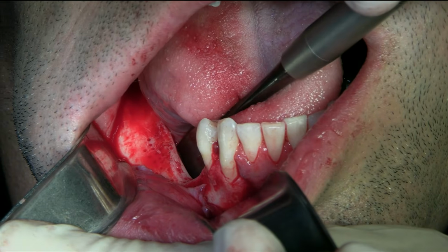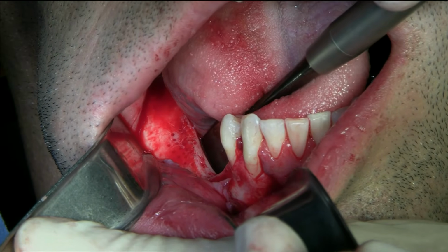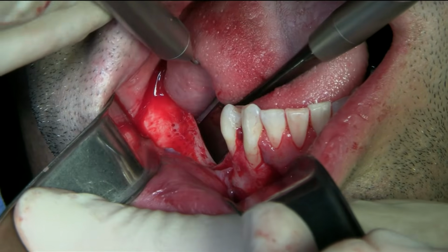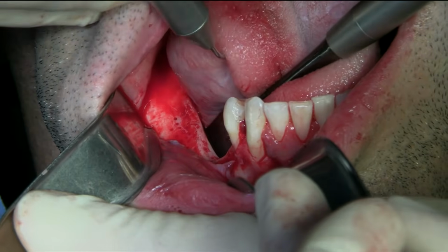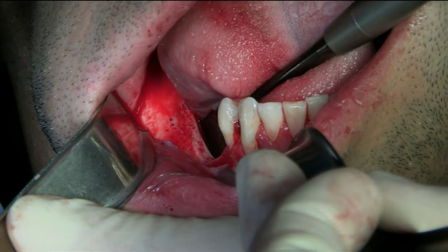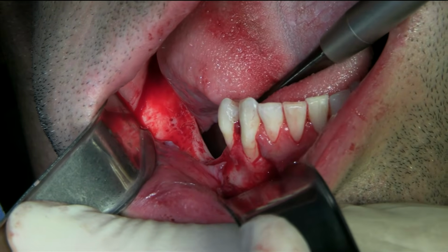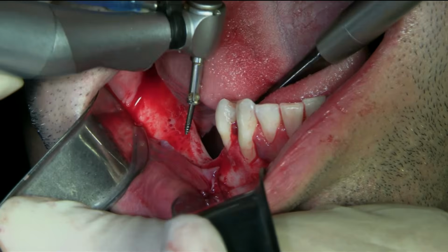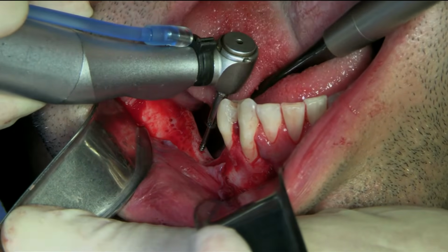And I'll place the membrane first, fixate it on the lingual, so we're going to have to fixate it here, somewhere here. And then this one will be tough here in the anterior. Okay, ready? Yeah, that's taller. Okay, so here we go. The other one is safe.